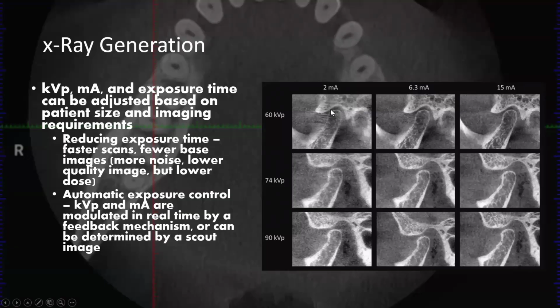We said for our intraoral imaging, typically it's around 65 KVP. That's ideal for really distinguishing those structures. But if you have a really large patient, maybe taking a large field of view, more of the adult settings, it might require a higher KVP just to have those penetrating photons to get an adequate image.